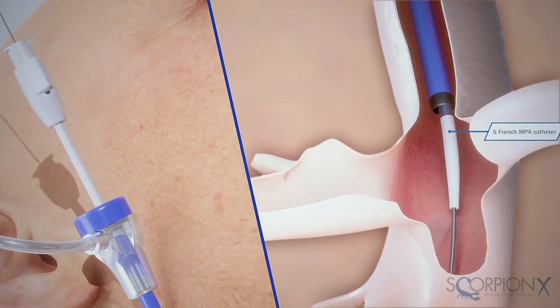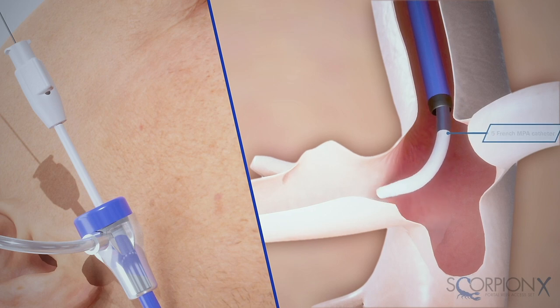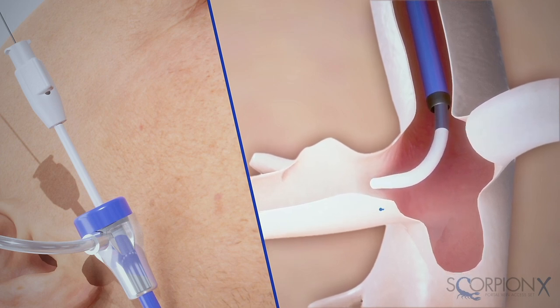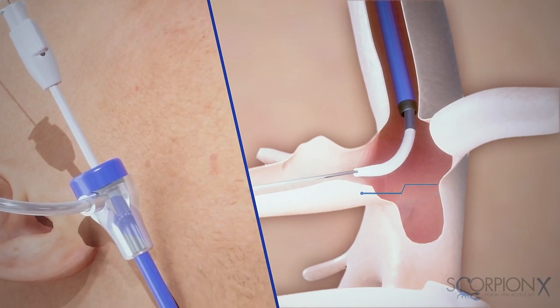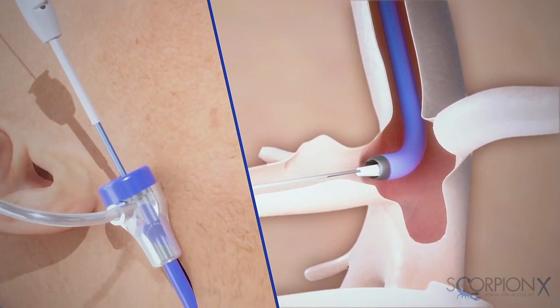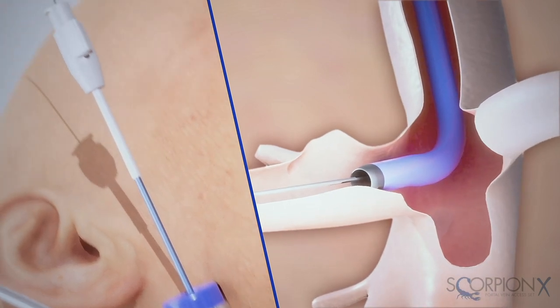Retract the guide wire, allowing the 5 French MPA catheter to gain access to the hepatic vein. After gaining access, advance the 10 French introducer sheath into the hepatic vein and remove the 5 French MPA catheter.